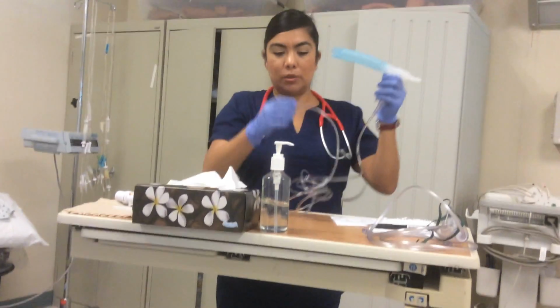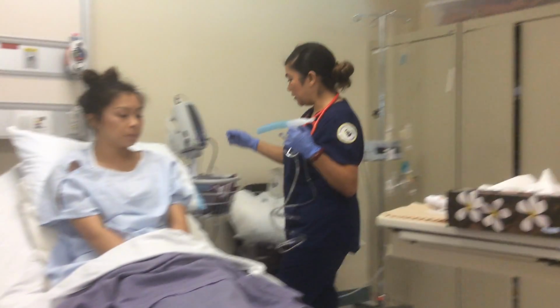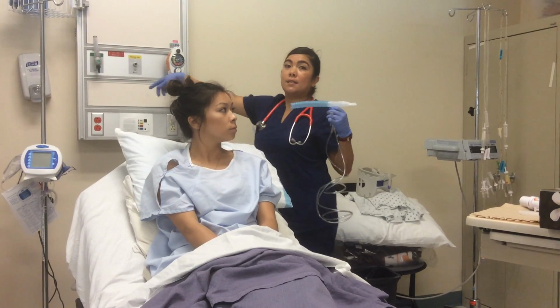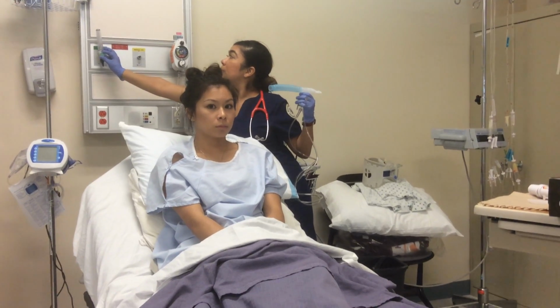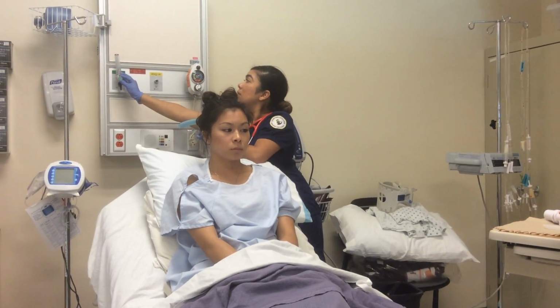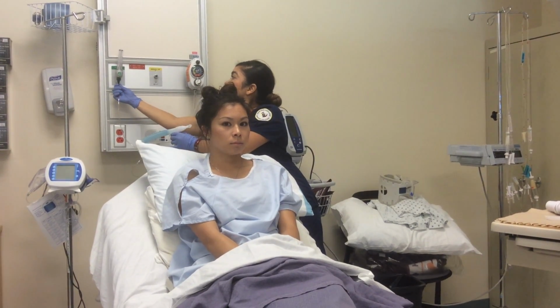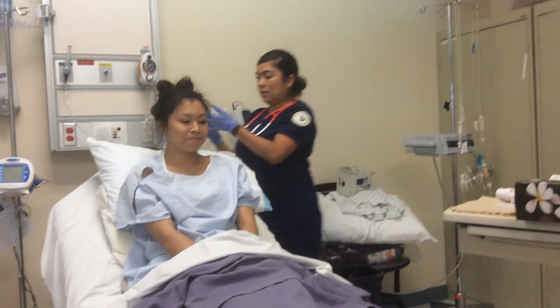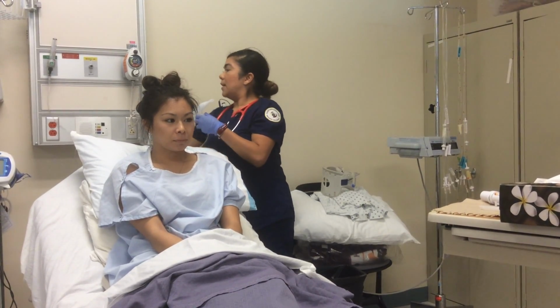And so, Ms. Adeno, I just want to let you know that you're probably going to be hearing a bit of a noise here. Okay? So let me just turn this on here. And then I would put this at anywhere from 6 to 10 liters. So I'm going to put this here. And it's at 7 liters. Okay, and I just want to make sure that I see the mist. Okay, that means that we're getting the medication. Okay, Ms. Adeno?